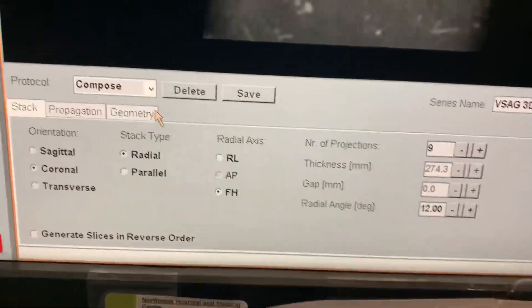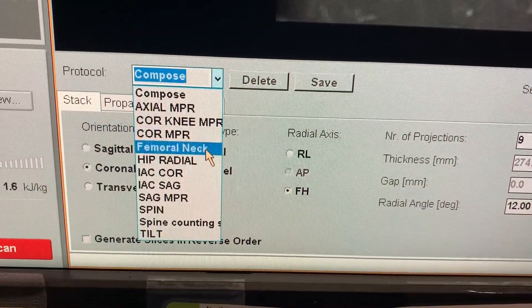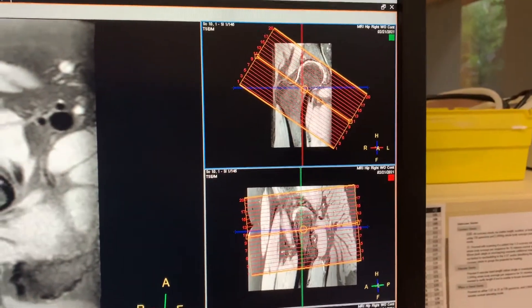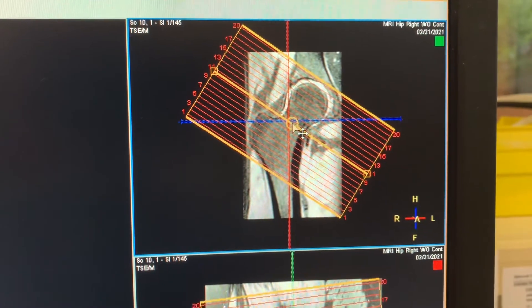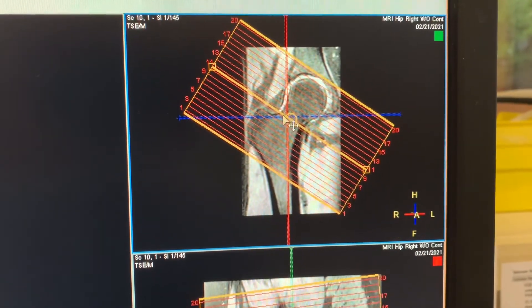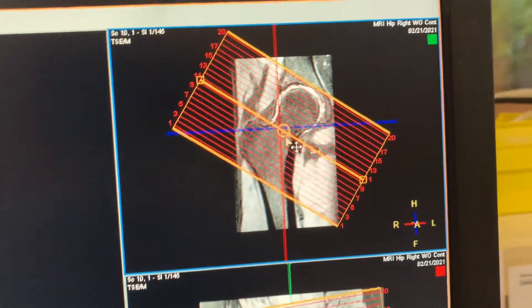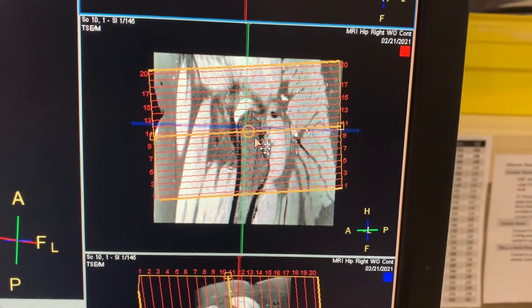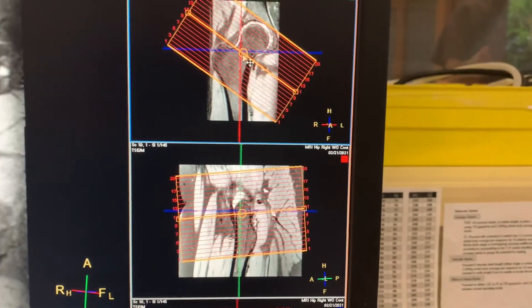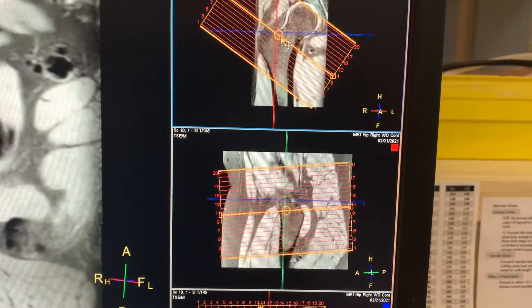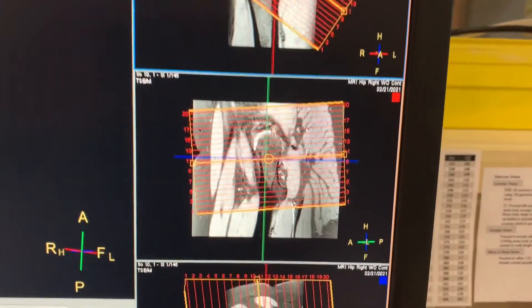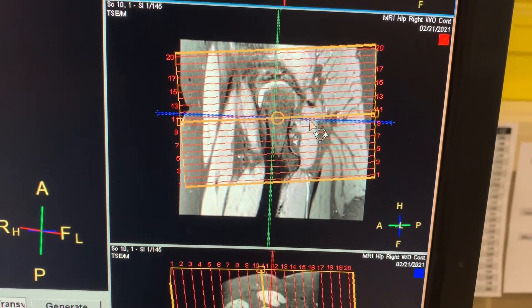Proceed to generate series. I created another template called 'femoral neck' — when you click on that you'll get the stacks. It has to be in short axis plane for the femoral neck, so you need to be perpendicular with the femoral neck. Then go into the second image, move it in and out to get the femoral neck well visualized, and tilt it until it looks pretty good.